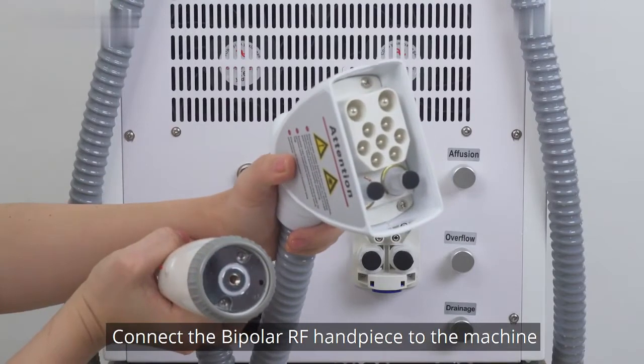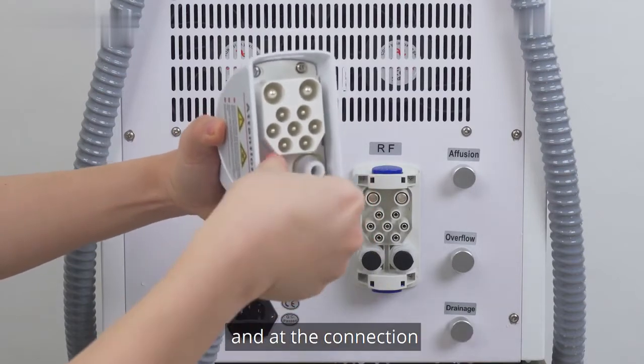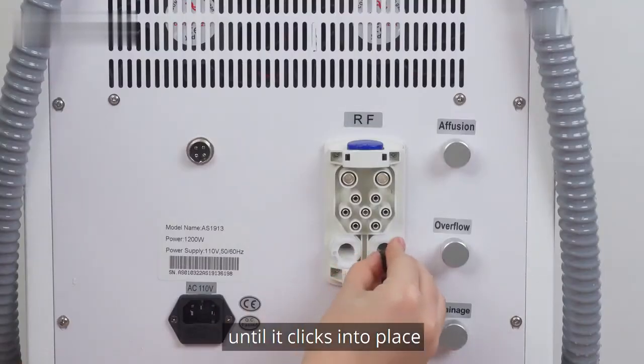Connect the bipolar RF handpiece to the machine. Remove the black rubber caps on the connector and add the connection. Insert the connector aligned with the small holes and push the connection until it clicks into place.